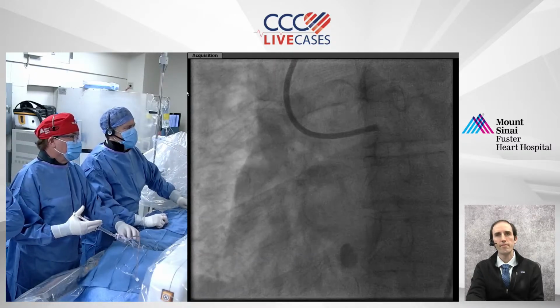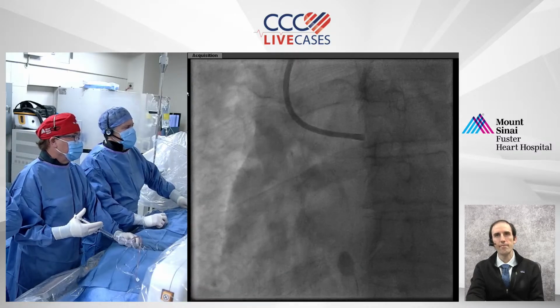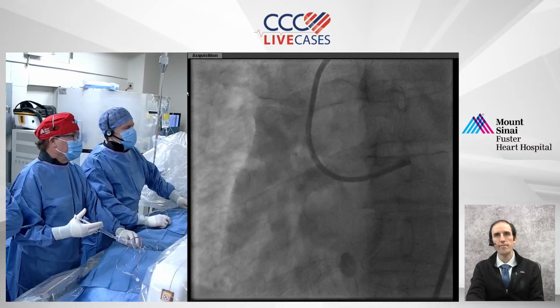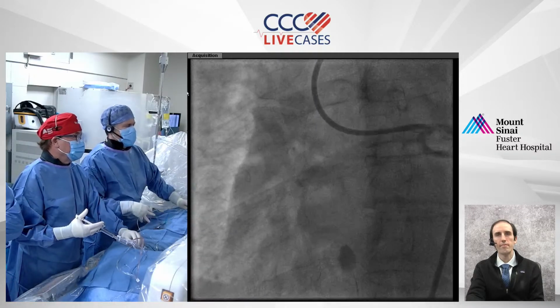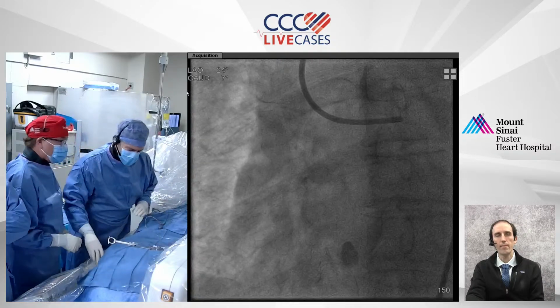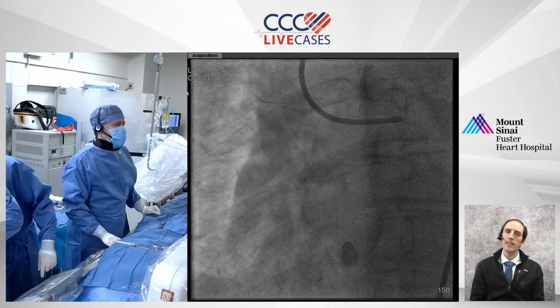This patient has a very short stature. My concern is that the short stature and the size of her wrist were so small that we would induce some vasospasm, and in doing so I'd probably have to give some vasodilators, which I didn't want to do. Right. Are you doing mainly radial, or how are you?